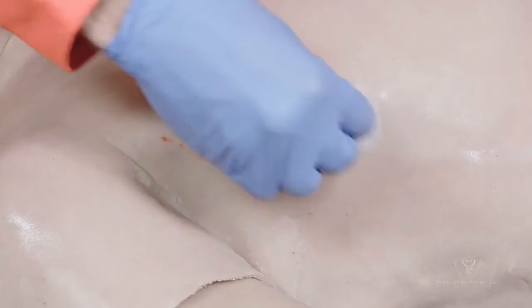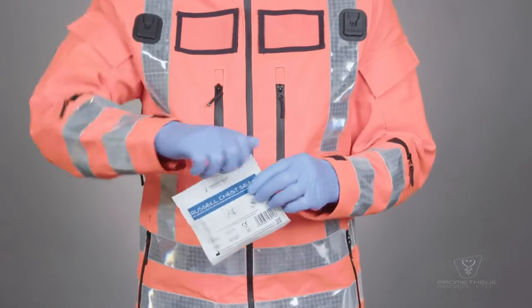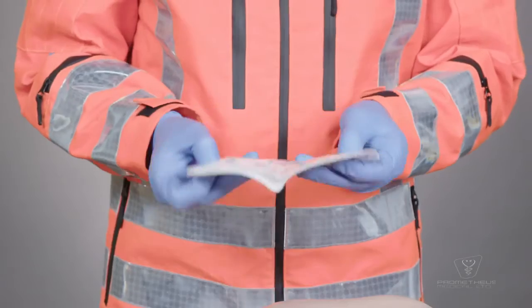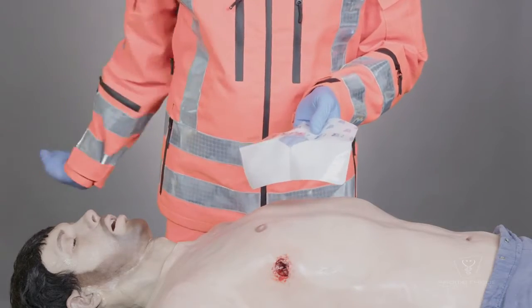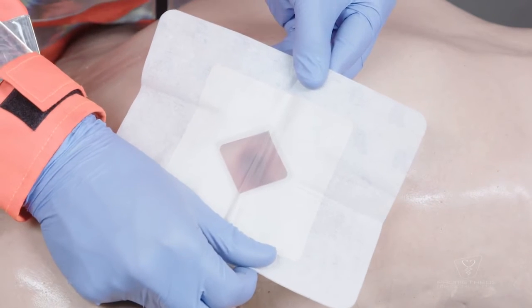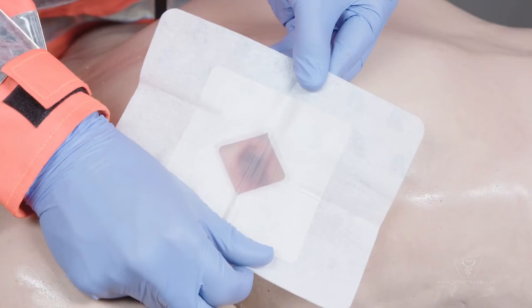Ensure that all loose debris or fluid from around the wound has been removed. Remove the Russell chest seal from its packaging and unfold it. Remove one of the plastic butterfly liners and align the device so that when it is adhered to the skin, the transparent central portion of the valve will be directly over the wound.